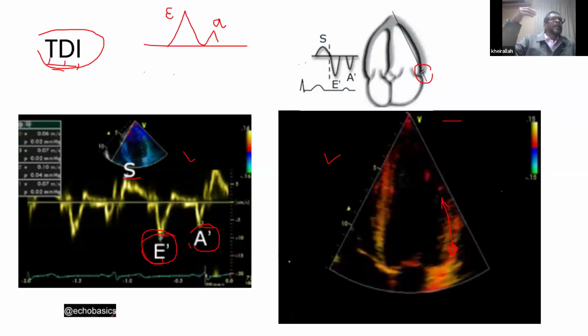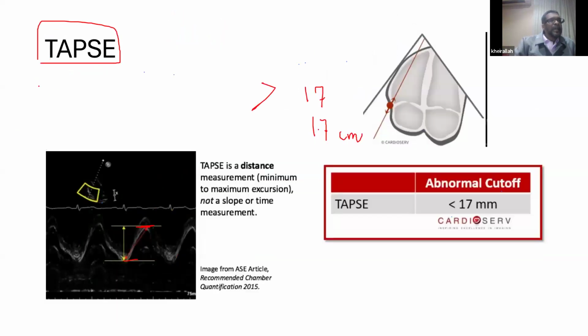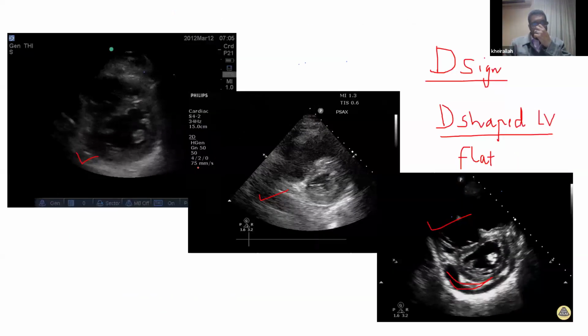As for the MAPSE and the dP/dt, it's just important to know, but don't employ them practically because they are not so common ways of assessment. Okay? And for the RV, it's important to know the TAPSE. TAPSE. Okay? It's very important. Otherwise, things are just like we have discussed.